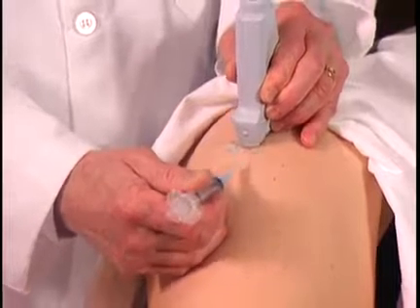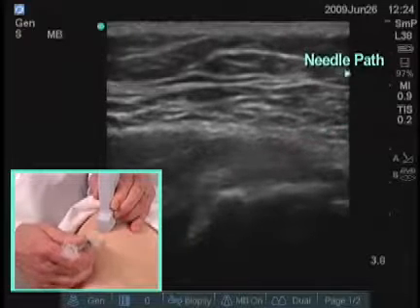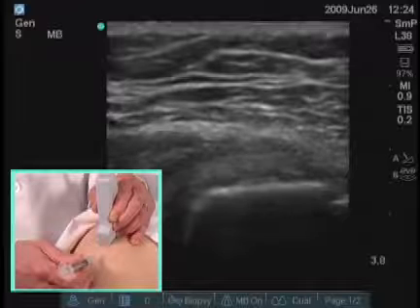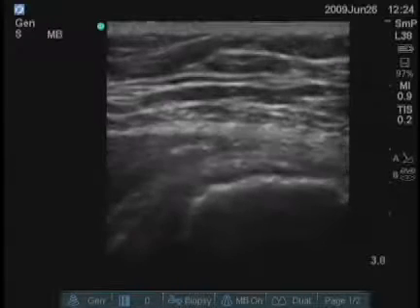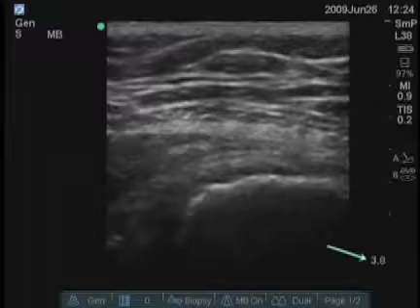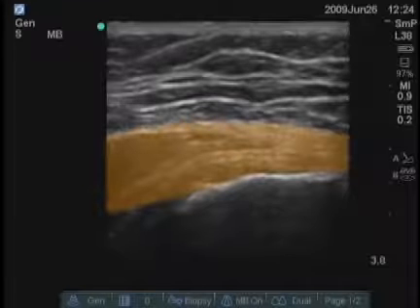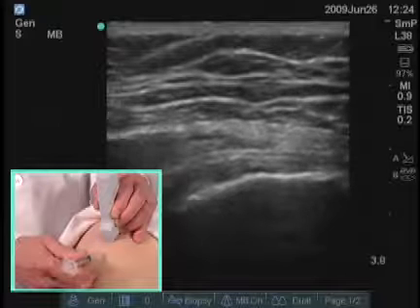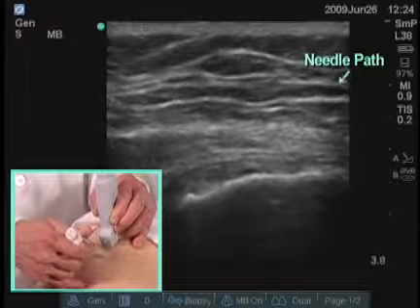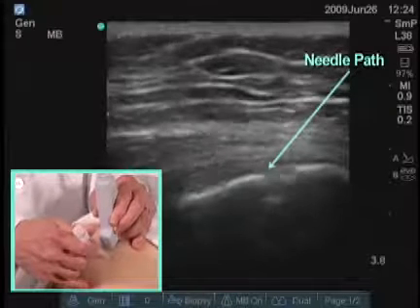I would then insert the needle approximately a centimeter away from the transducer. The closer you get, the more steep the angle has to be to get down to this depth, so sometimes it's better to be a little distance away from the edge of the transducer. By looking at the screen, you can see that the depth of the marker is nearly four centimeters, and the surface where the tendons are and the bursa is down about two and a half to three centimeters. So I'm going to have to get an angle that gets this down to the depth, and the angle will be changed by me as I enter the skin to direct the tip into the structure that I'm aiming for.